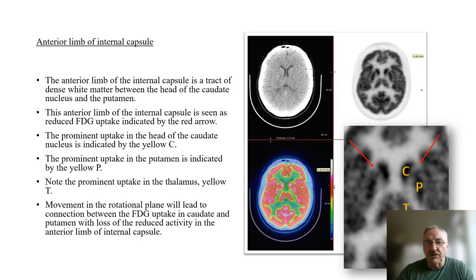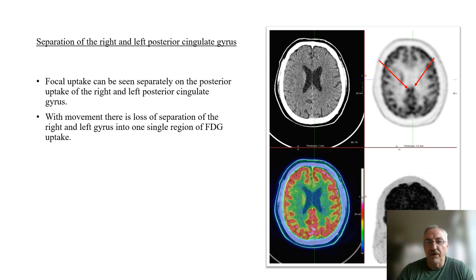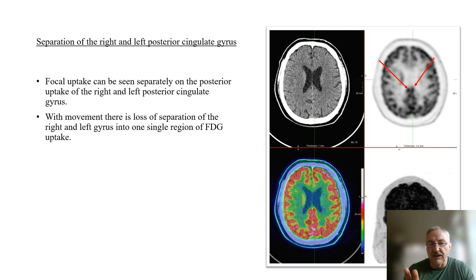The second quality indicator is the anterior limb of the internal capsule. There should be clear separation here between the head of the caudate nucleus and the putamen. This can be lost when there's movement and rotation of the brain. The third component is to identify both the right and left posterior cingulate gyrus. They should be seen in their parallel components as two separate structures, and where there is movement — both rotation and yaw — this can be lost.